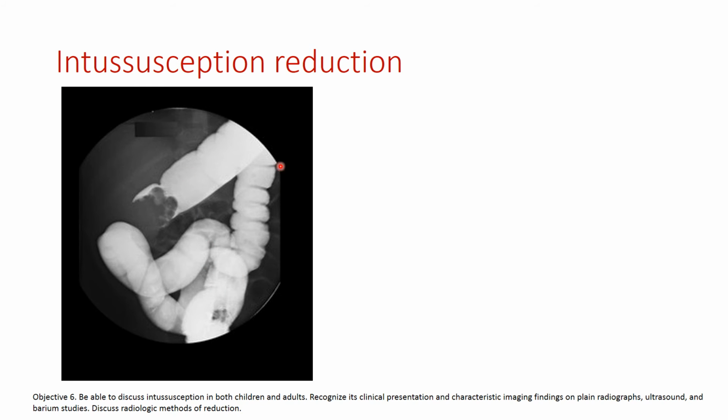Normally we will try up to 3 times. There's a whole protocol. I was going to give this one try, and I put the barium in and just prayed that the bowel wasn't already necrotic and that I was going to tear the bowel and this barium was going to go all over into his peritoneal cavity and the kid would die right on the table.